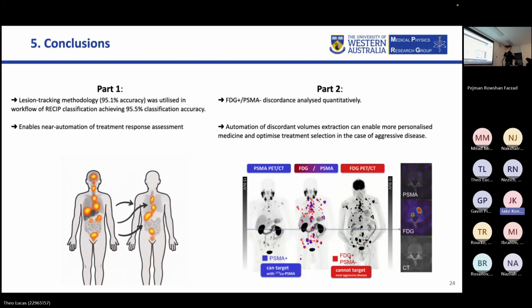So it's not going to overlap as much with the other lesions, which is why under automatic dilation we seem to have generally good performance across the categories. But if you apply a fixed dilation radius, it's going to be the same radius for every lesion no matter where it is. That might impact the performance of the algorithm, which is what we saw in the dilation sensitivity.